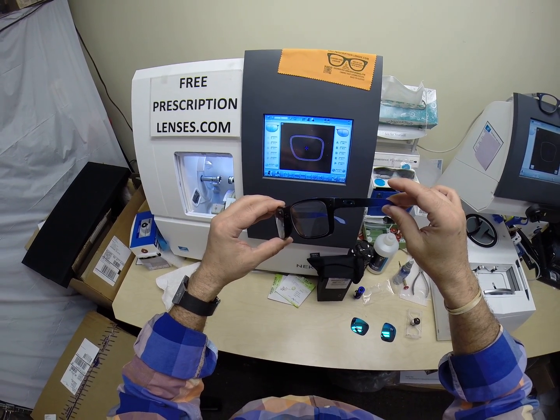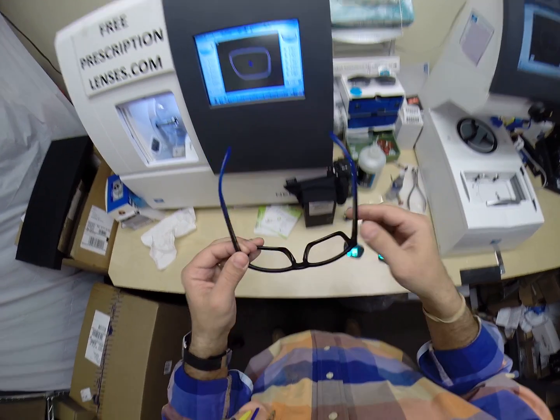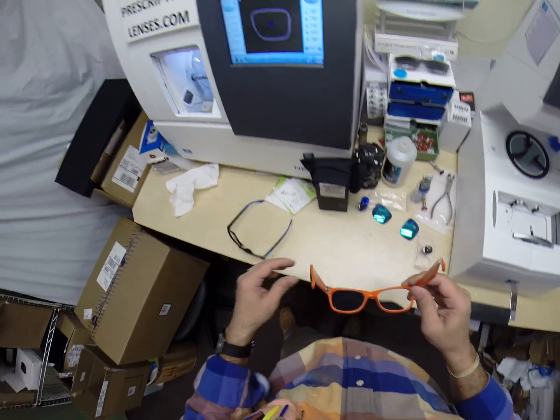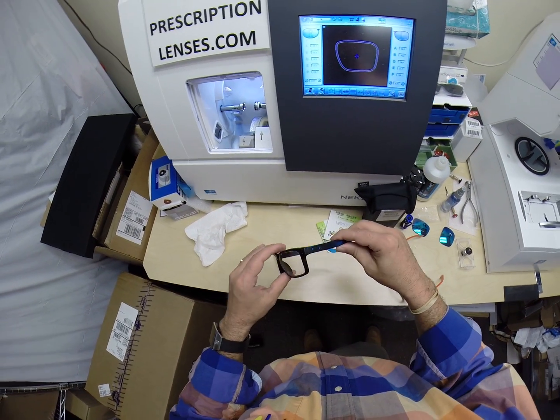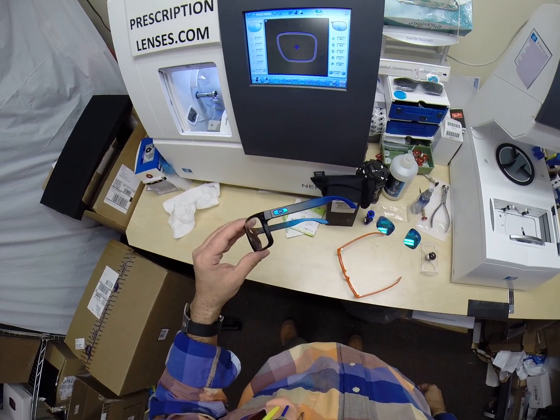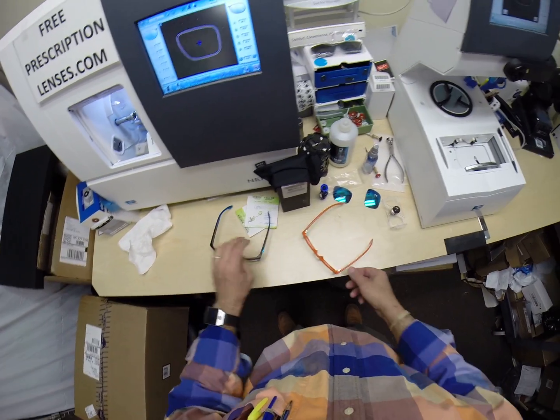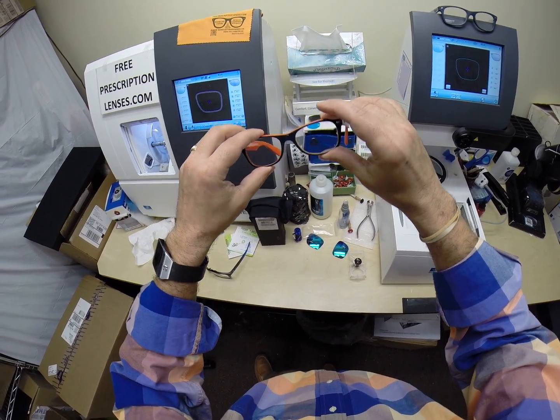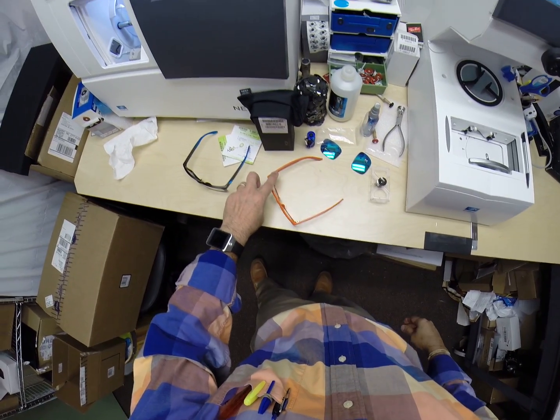But also, I'm going to get these in standard alignment, also known as a 3-point stance. The 3 points are 1, 2, and the bottom of the frame being 3. I set them down on the counter and press down. There is no wobble. And when I say wobble, 80% of people have one ear that's higher than the other, and that's why every pair of glasses needs to be adjusted. So just stop by your local place and tell them, because of that, 99% of all optical shops will do free adjustments. Tell them if it's too loose or too tight, or if it's uneven on one side. Because like I mentioned, 80% of people have one ear that is higher than the other, and I'm no exception. I'm part of that 80%. When I take mine off, mine wobble on the counter, but they sit level on me.